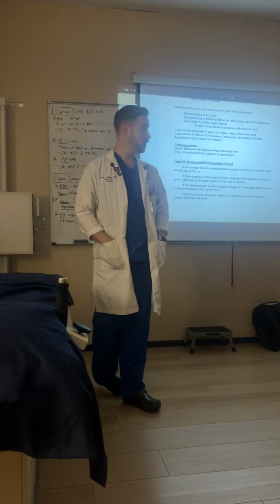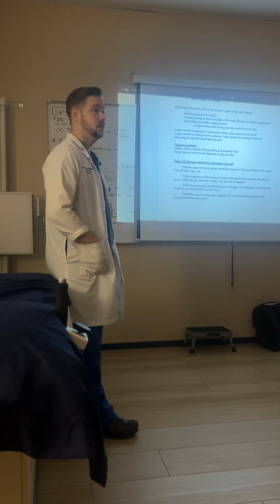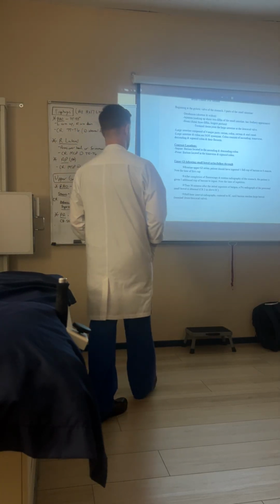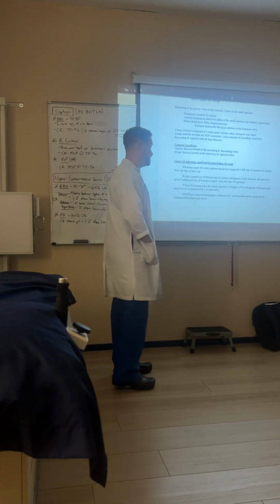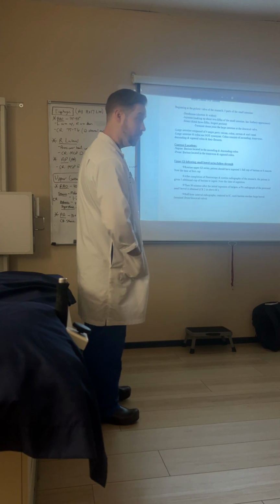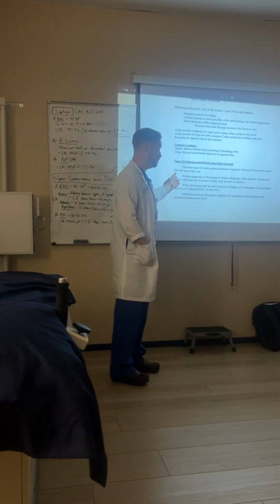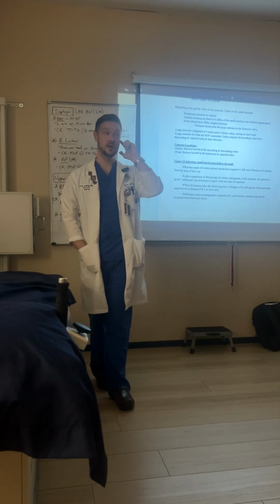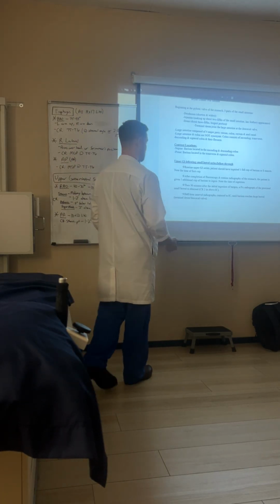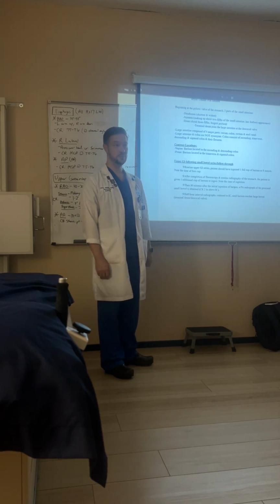Patient should have ingested 1 whole cup of barium or 8 ounces, and we're going to note the time of their completion of that first cup. After the radiologist does his fluoroscopic examination and we do our radiographic overheads if we need them of the stomach, then the patient is going to be given 1 more additional cup of barium to ingest, and we're going to note the time of their completion of that ingestion as well, okay? Then begins the timer for us to follow through the barium, okay?